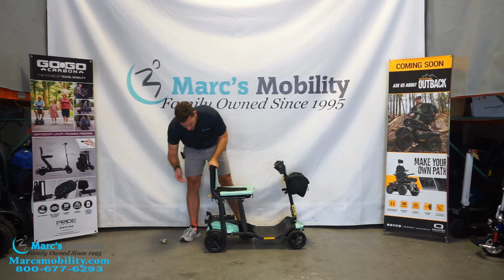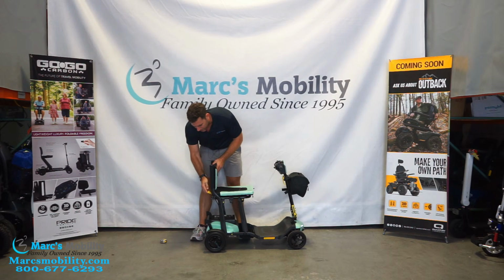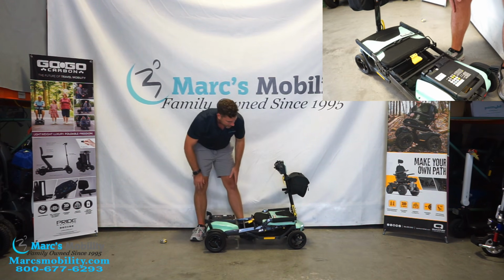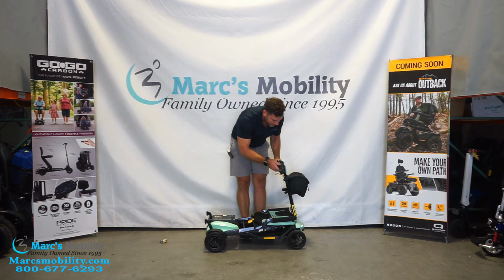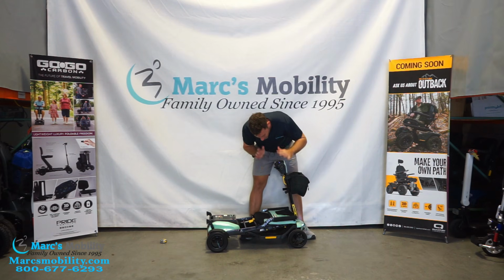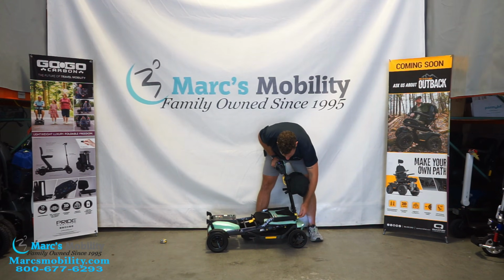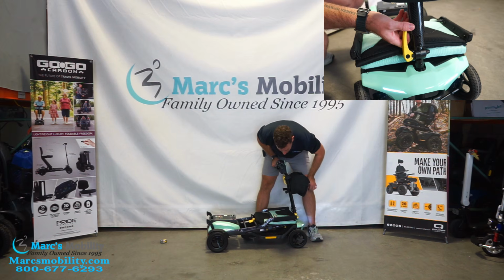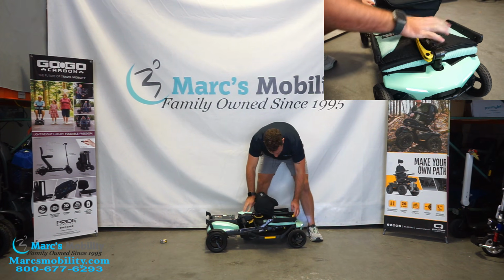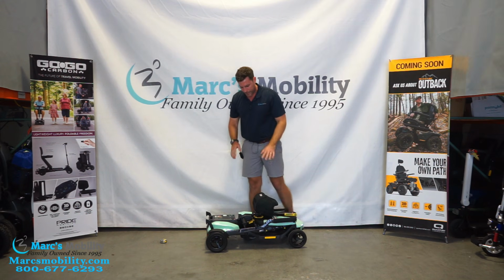So in order to fold this unit down, you're going to have a yellow tab here in the back. If you lift that up, your seat is going to begin to go forward and it's going to click in place. Now they do recommend this is height adjustable on your tiller. Mine was already all the way in the down position, so I don't have to lower the tiller. And then you have this knob. It's still interlocking teeth like you had on a lot of other units, but it's got a handle to lock it in place. So once that is down, you lock it back in place, and this is what you're looking at.